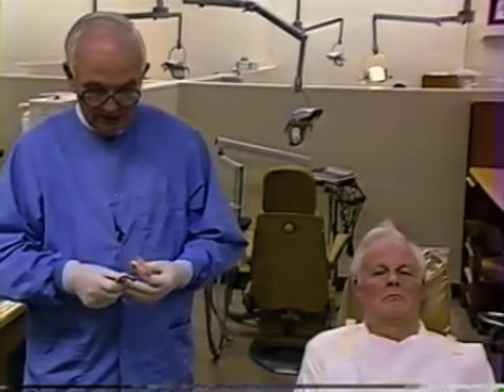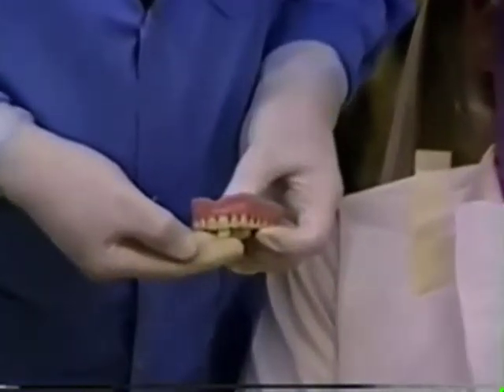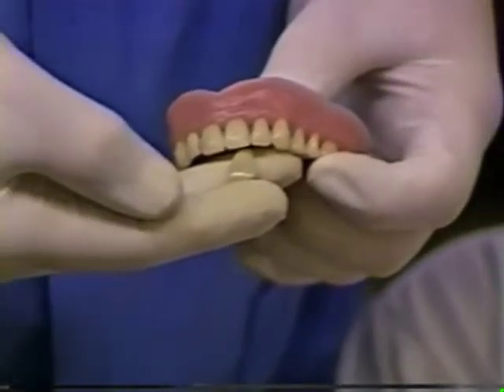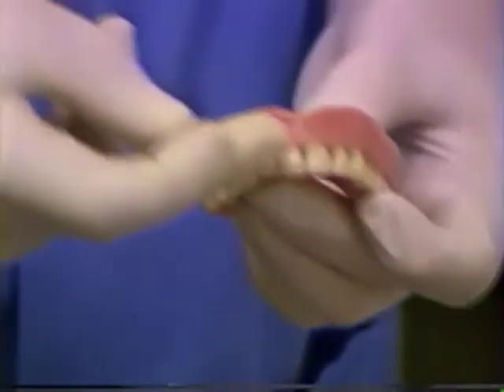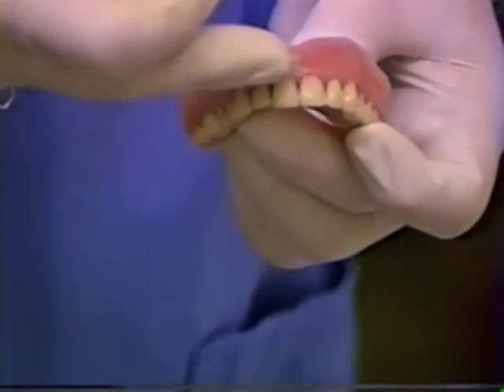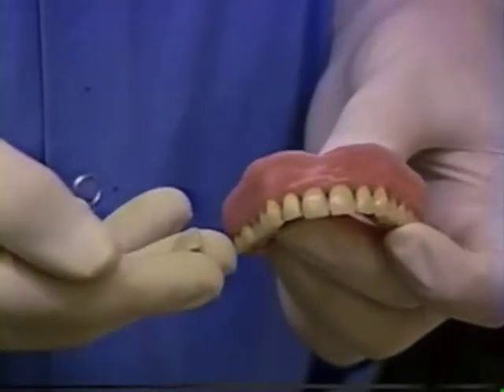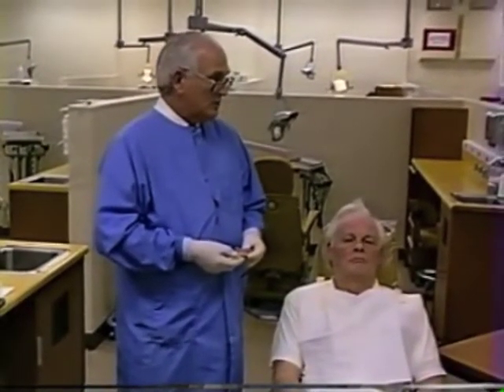Looking at the central incisors, which have the biggest impact, the size is very similar between old and new — very little difference. So size and shape those teeth will work quite well. The color will have a similar incisal edge to the old teeth, but the body of the tooth will be a little more lifelike with more saturation of color toward the gingiva. We're going to use mold 22E, shade 109 as our preliminary selection, and confirm aesthetically at the next appointment.